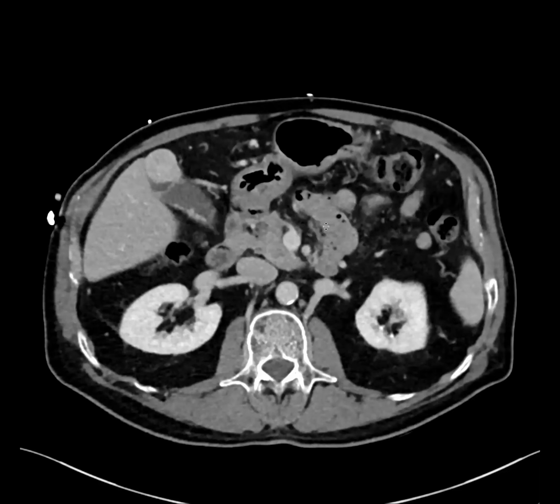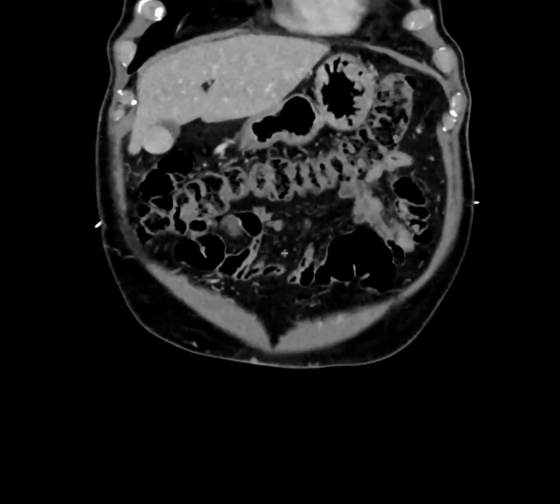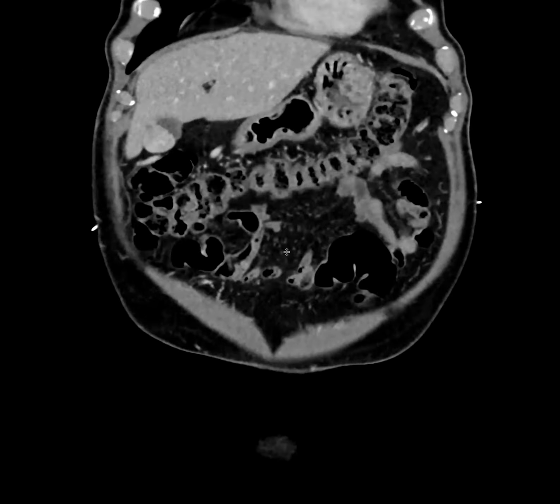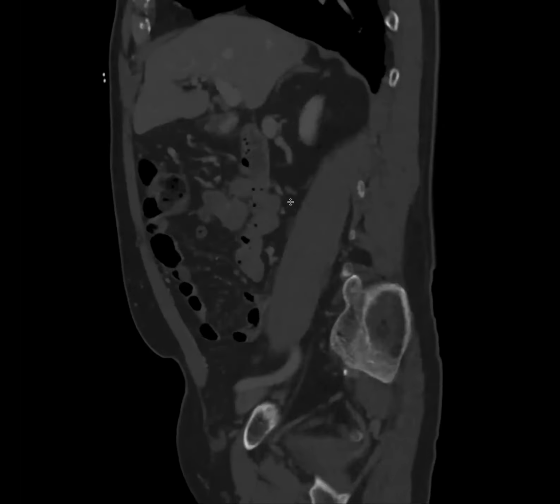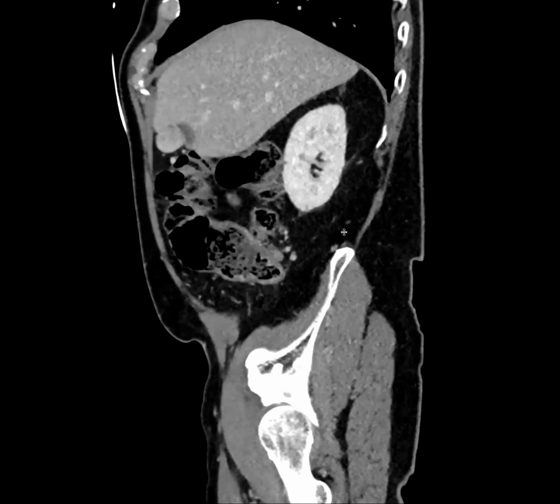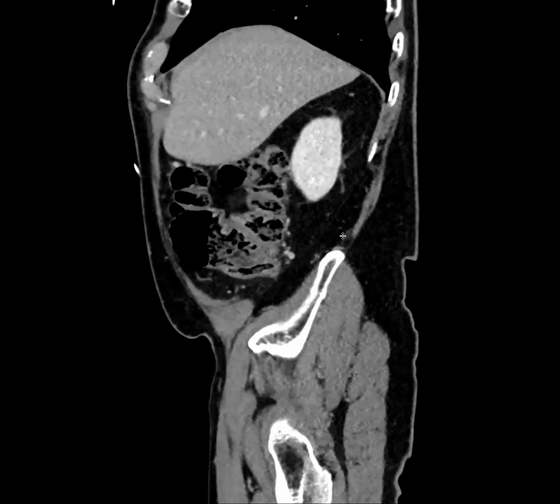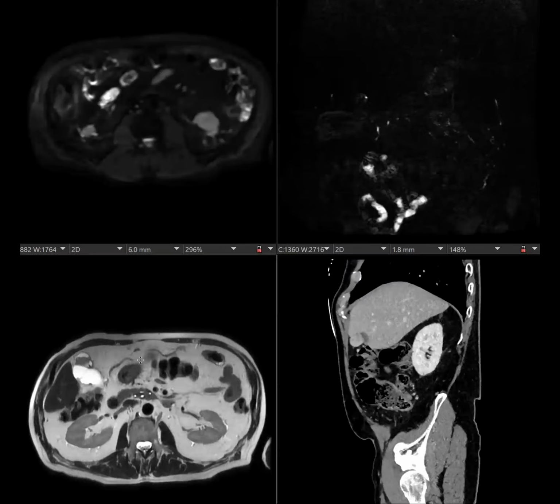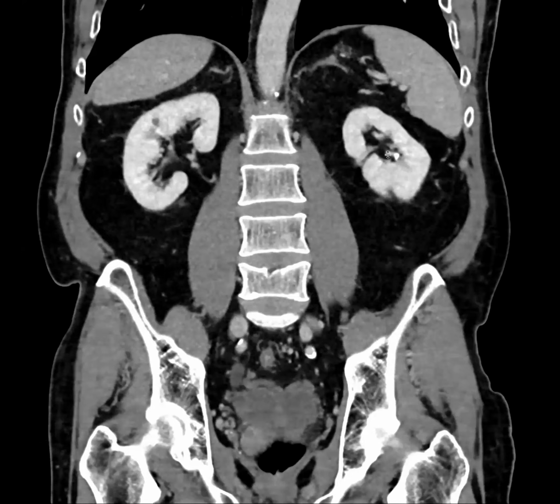But Nelly, I want to say one thing about the gallbladder fundus mass. Yes. I have seen a paraganglioma of the gallbladder. So that's coming to light. It does not look like a normal gallbladder cancer. Yeah, those are ugly. This is not ugly. This almost looks a little bit like liver tissue, but here it is. Don't even tell me it's ectopic pancreas. No, it's not fluffy enough. I don't see any ducts. Is there a spleen? Yes, I believe so. Making sure we're not looking at ectopic spleen. Spleen's fine.